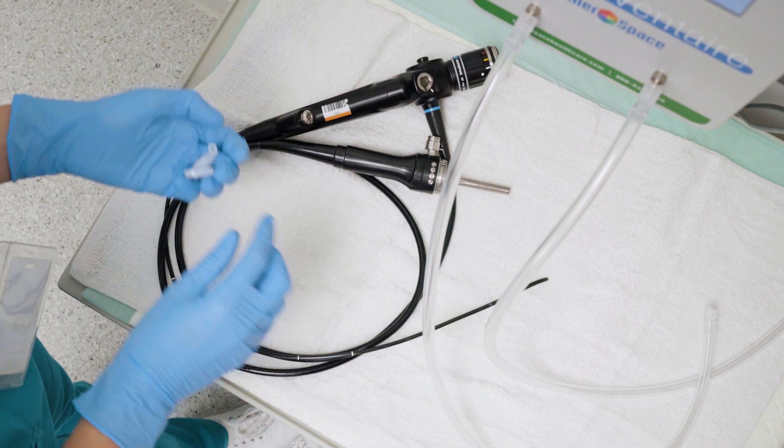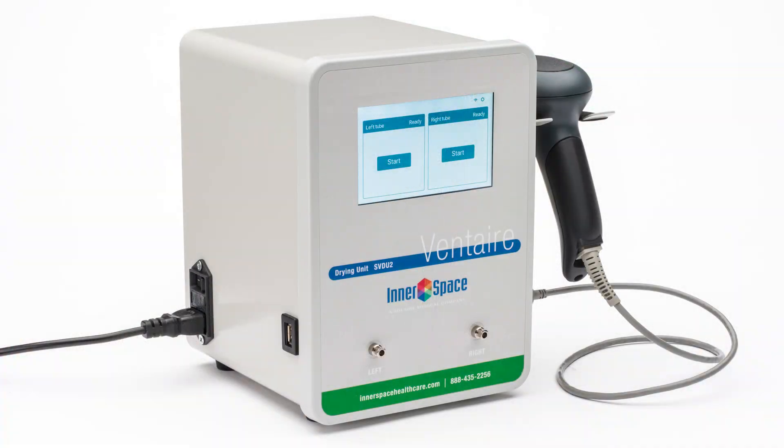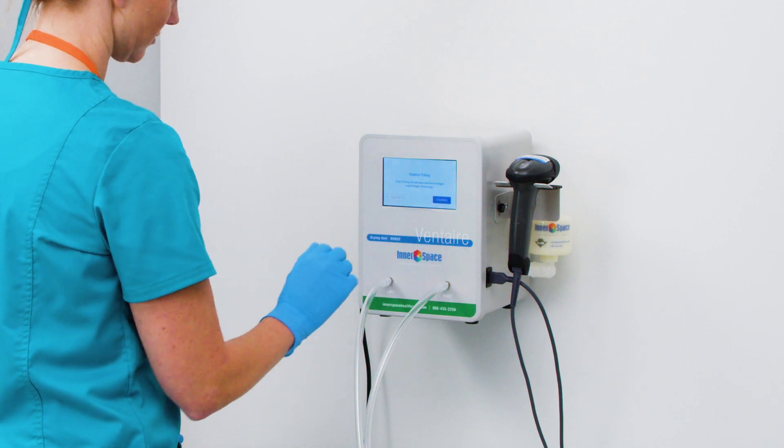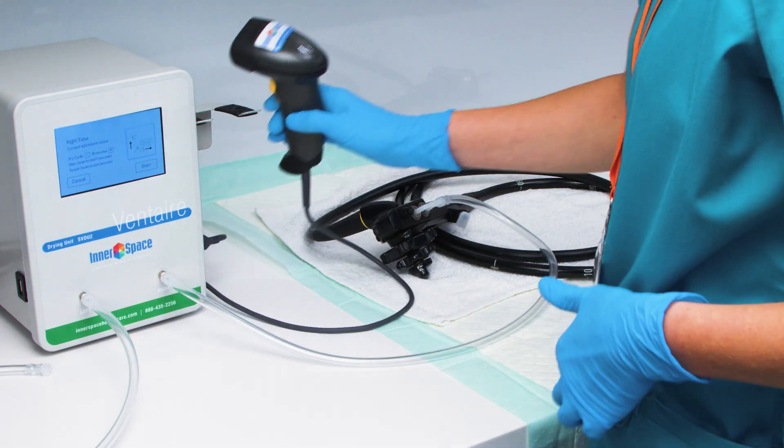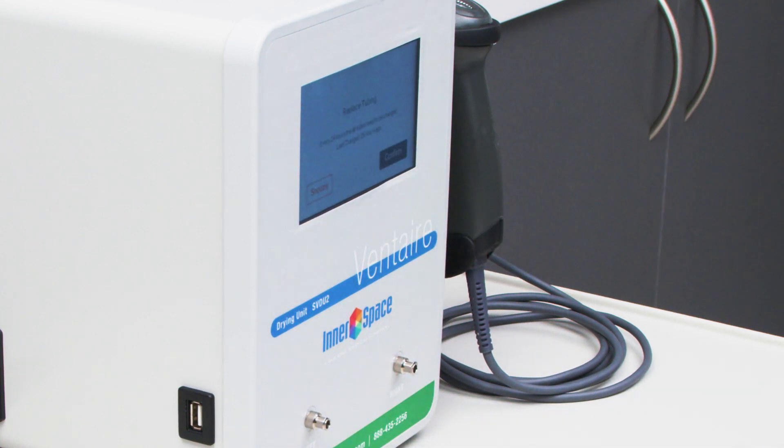The Drying Unit works with all major endoscope brands. Drying units are available in two versions: one includes a compressor that supplies air, and the other connects to a building's air supply. The display and intuitive interface makes setup and monitoring easy and clear, and a few simple steps initiate drying.